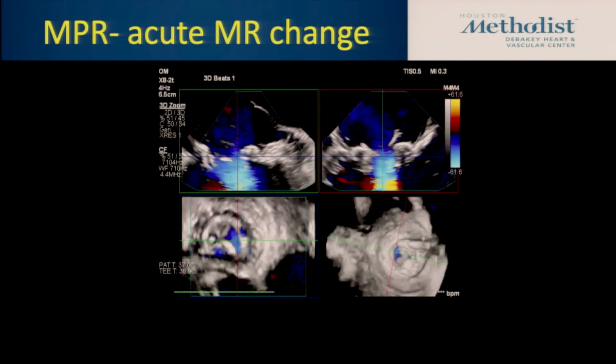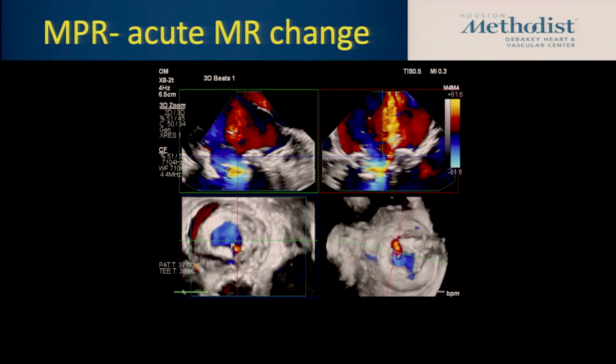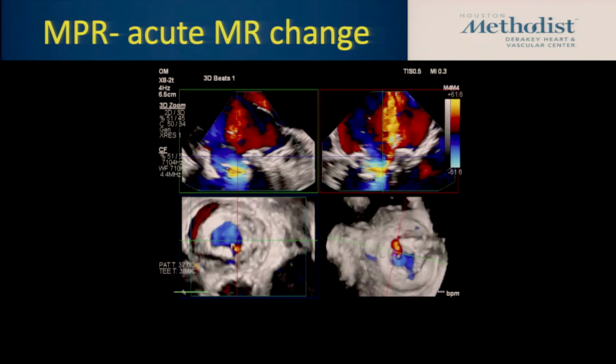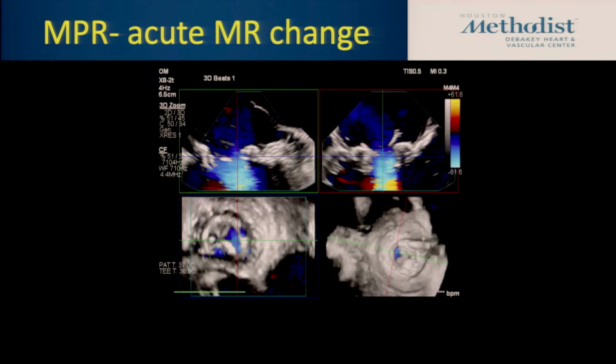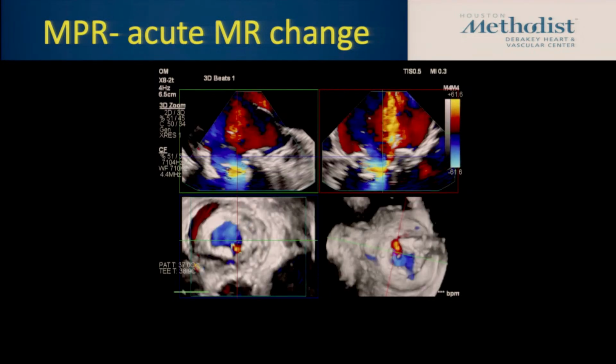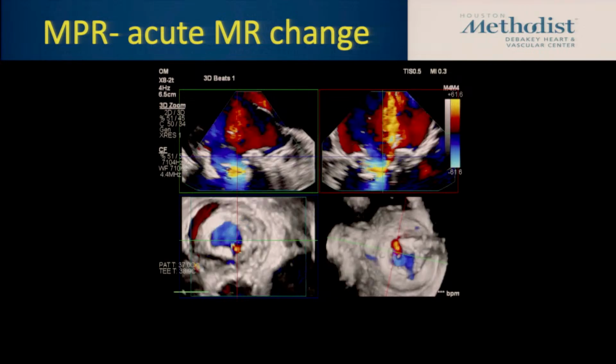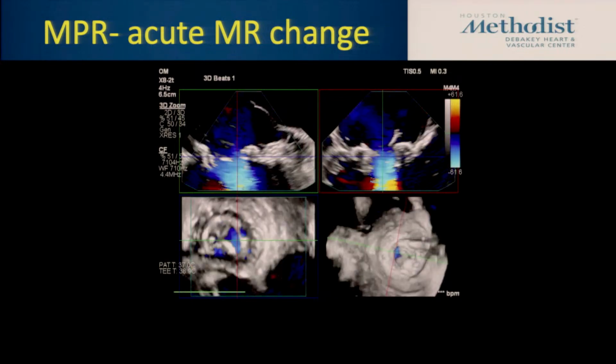What's happened is we've got a wire across the valve. The anesthesiologist is saying the pressure's dumping because you're holding the valve wide open. You have to recognize that because interventional cardiologists get kind of busy doing their thing. They're doing exchanges, pressure's falling. The MR was only mild a minute ago, now it's severe. So casually you can interrupt valve function. You have to be aware of how fast you can evaluate that and just tell everybody, move your wire, you're holding the valve open.